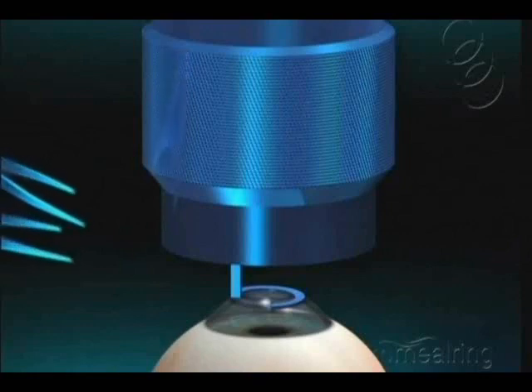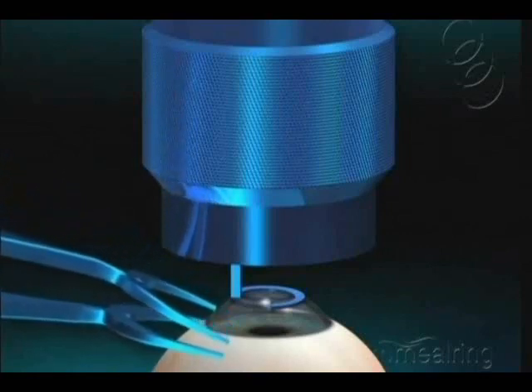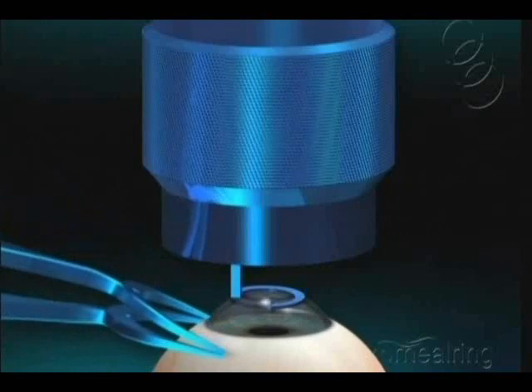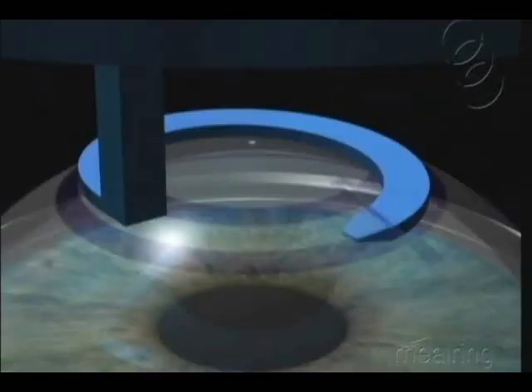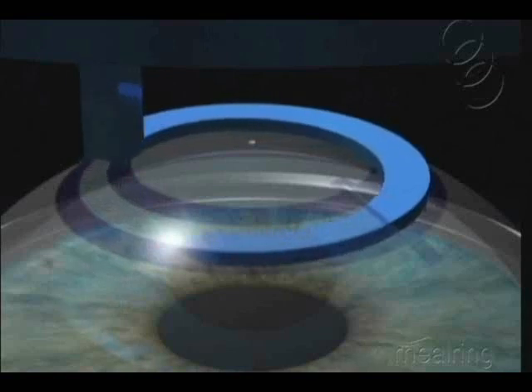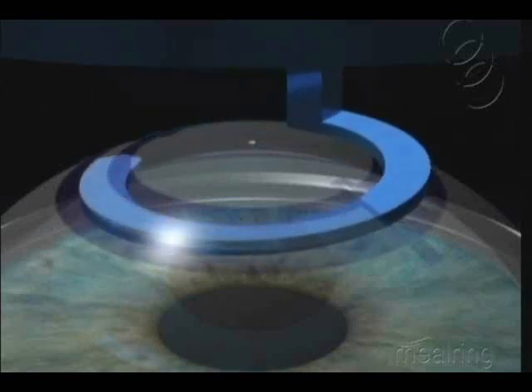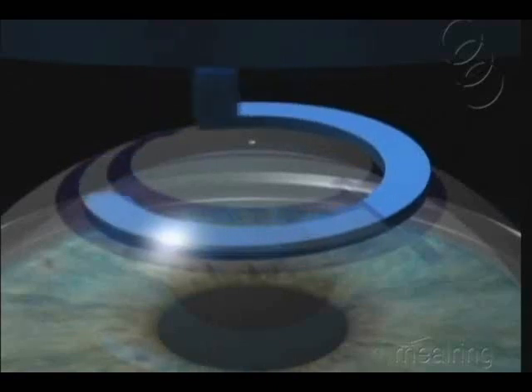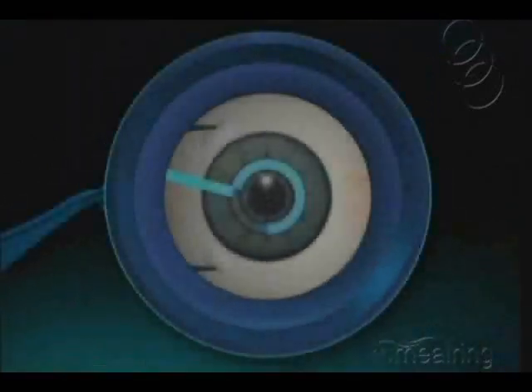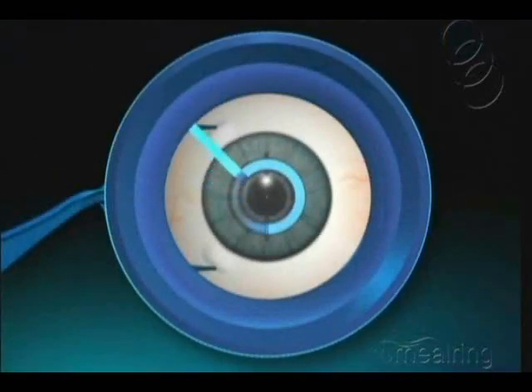Hold the eye using the Kremer forceps. Turn the dissector slowly, making sure the tunnel stays exactly inside the tunnelization zone marked on the cornea. Do not force the dissector up or down. Don't tilt the dissector along the way.